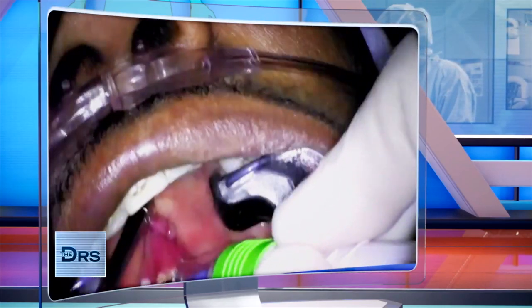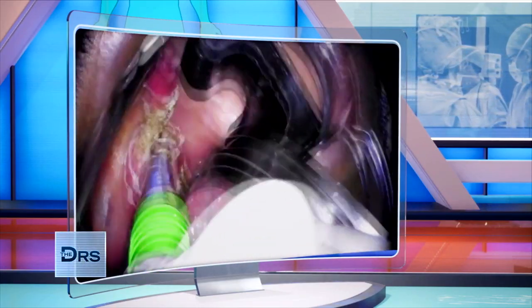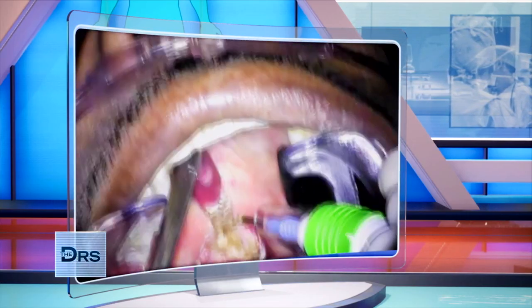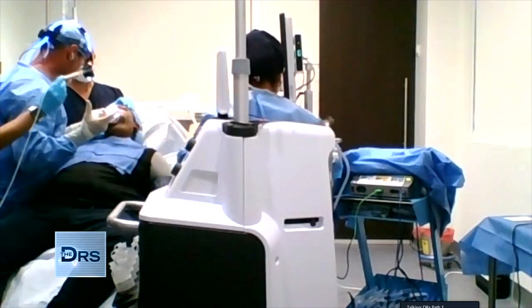So Dr. Mandel, you're removing that excess hanging part of the uvula, correct? I am. And you can see I'm kind of teasing out some of this muscle here, which is actually kind of an important part of this as well. Right. Bloodless. Beautiful. So that's that. Okay, so that's the hardest part of the procedure right there.